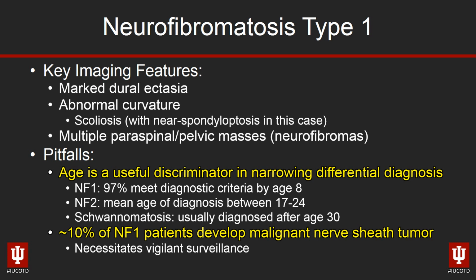And so again, it's really important. You can sort of get lulled to sleep looking at multiple follow-up studies on these patients. It's important to keep in mind, what's the growth pattern doing? Is it demonstrating accelerated growth? And if so, that's something that you want to keep in mind, could be a suspicious finding.